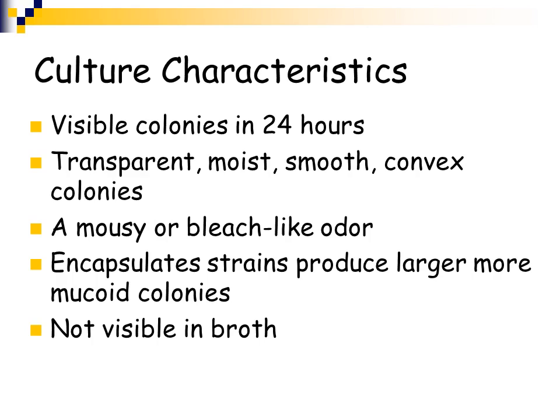Sniffing a plate can possibly cost you your job. It's frowned upon because there are organisms out there like Neisseria meningitidis and many others that put your life at risk if you sniff the growth. So you do not want to ever sniff a plate.